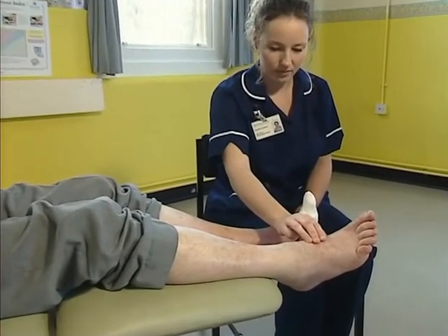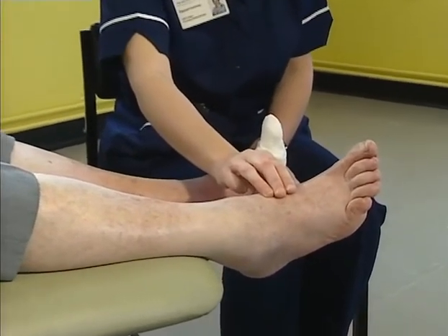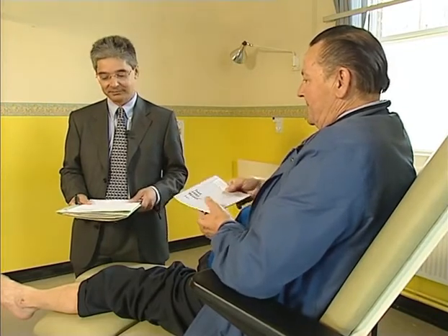We have shown you a brief examination of the diabetic foot, testing for peripheral neuropathy and vascular disease. It is important that we assess patients in a structured and standardized way and record our findings. It is equally important to explain to the patient what we're doing, as this will form a basis for good health education and a better patient-practitioner relationship.